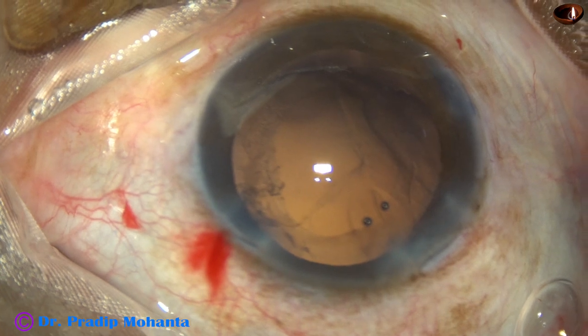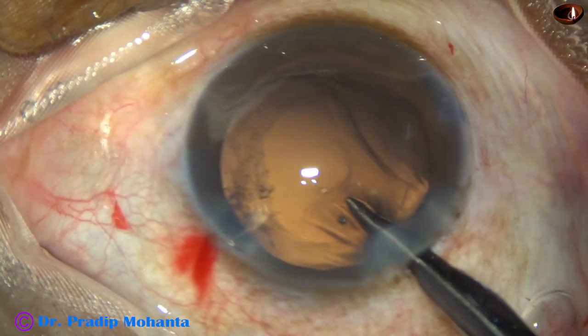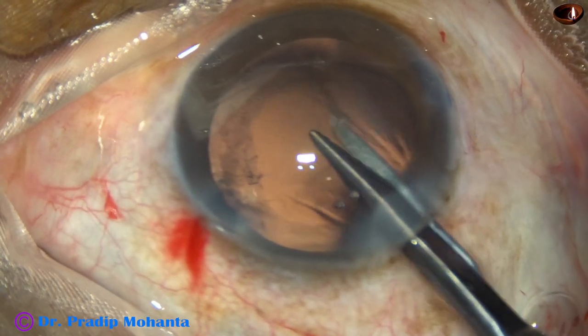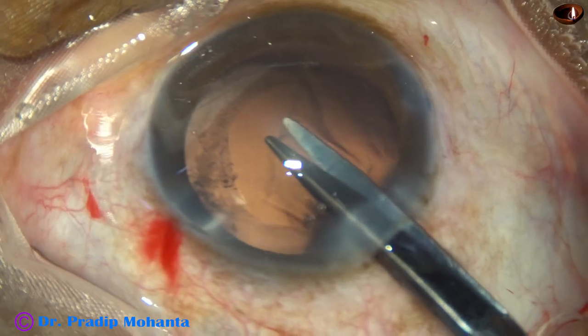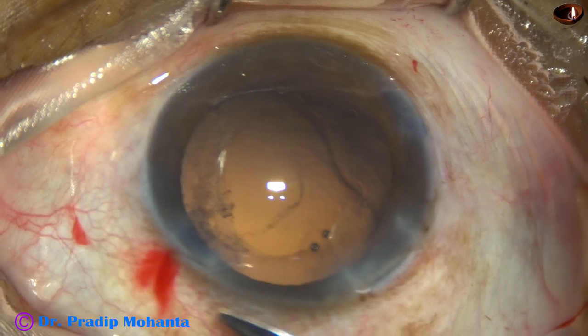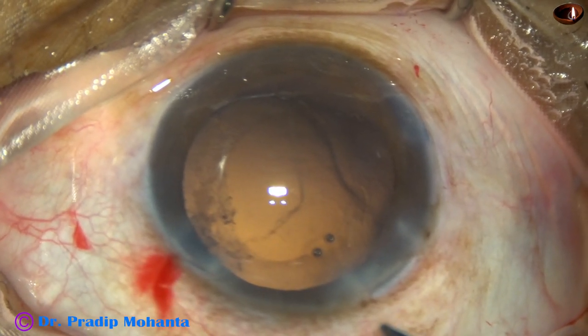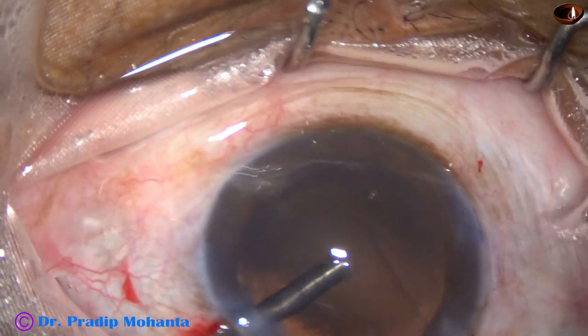There is another vitreous strand which is hooking the posterior capsule. I take the Vannas scissor again and cut it. Then I use the vitrectomy cutter.